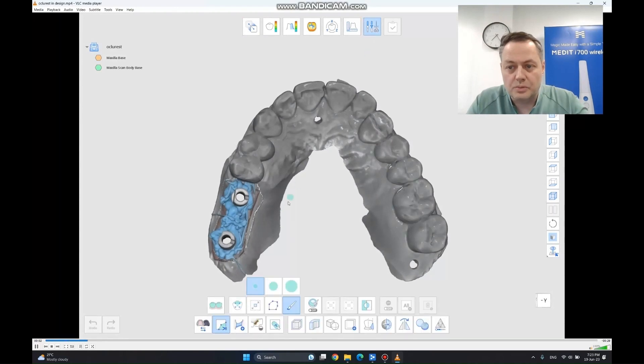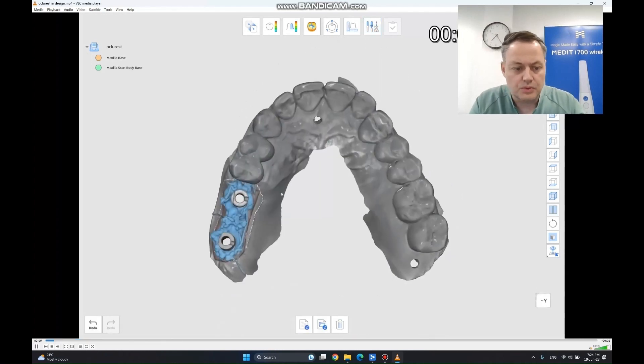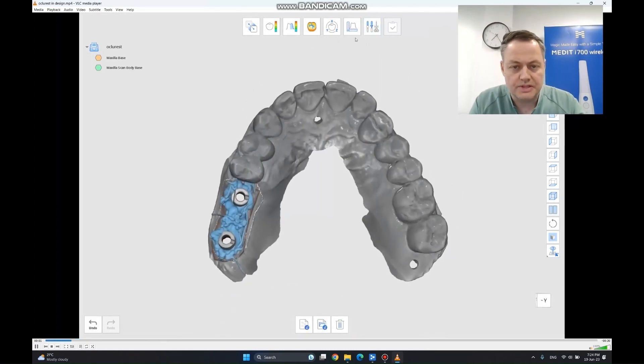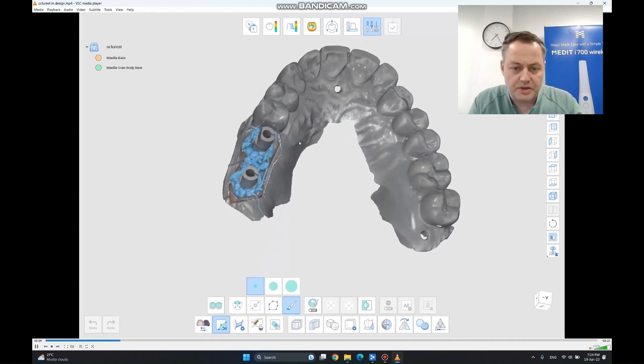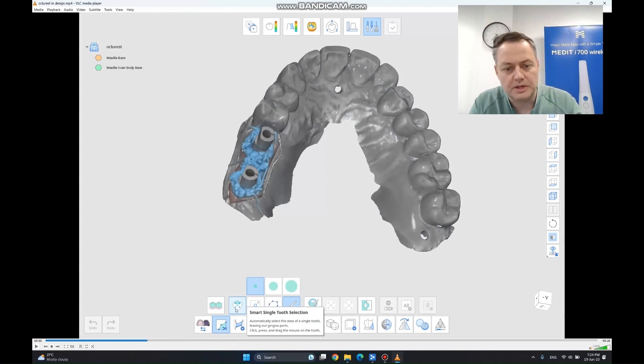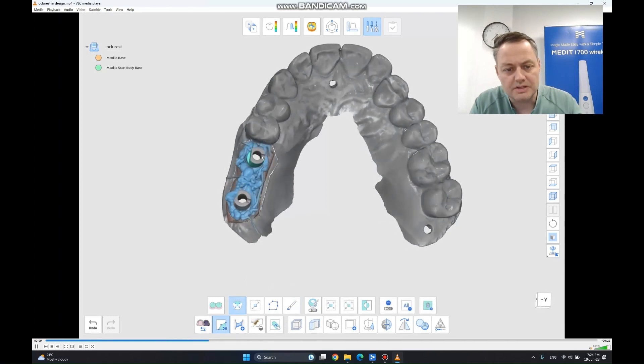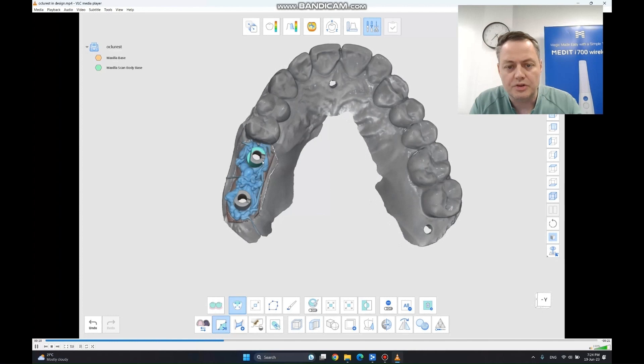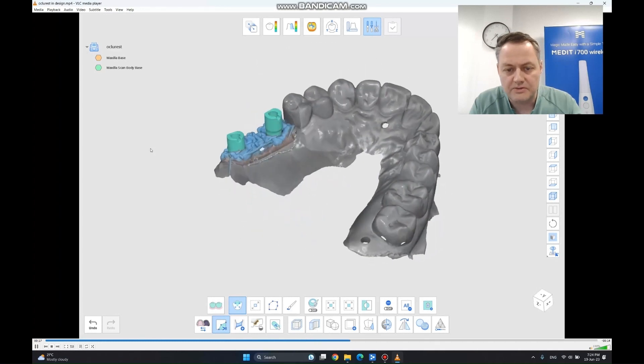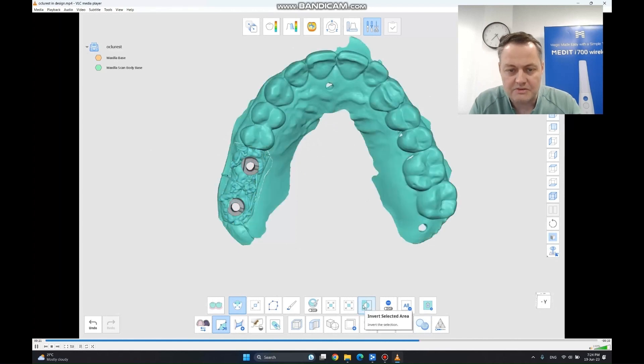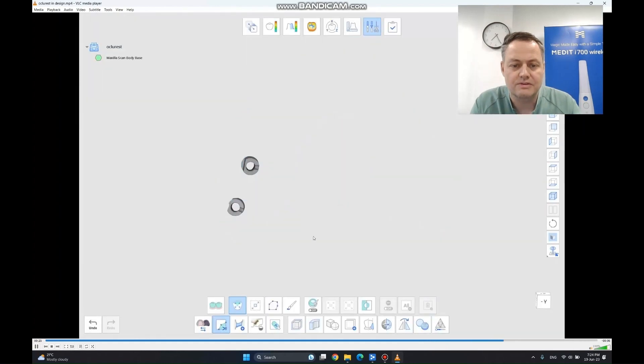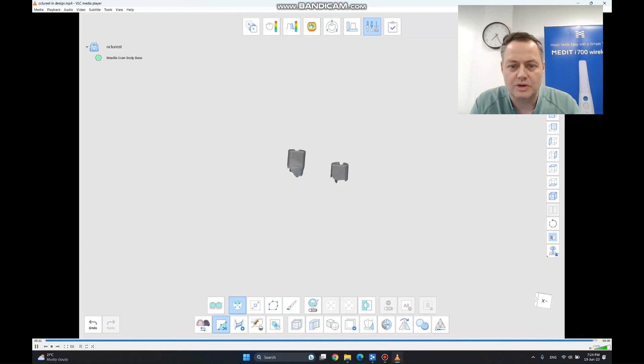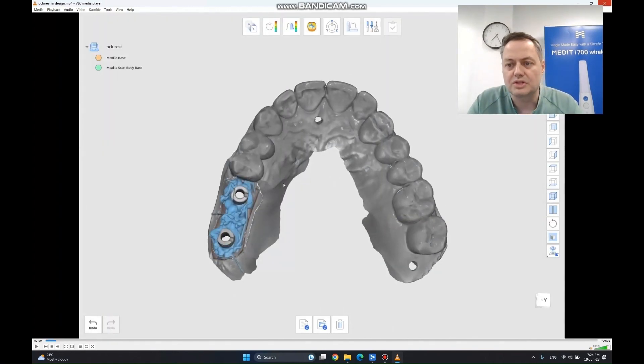After opening the MEDIT Design application and importing all the data, you will see that we go in the trimming tool. We are going to use the smart single tooth selection. It is a very good tool for what we are going to do now. We are just going to click on the scan bodies. Let's add some more and do some more clicking on the parts that don't auto-select. The second scan body goes easy as well. After we have finished this and we have the scan bodies selected, you just invert the selection. And now if we delete everything, we are just going to have the two scan bodies that are going to be exported back into MEDIT Link. This is going to go to your technician.